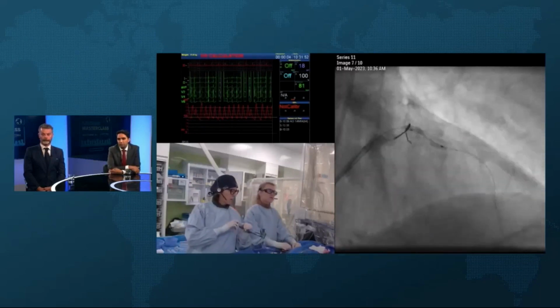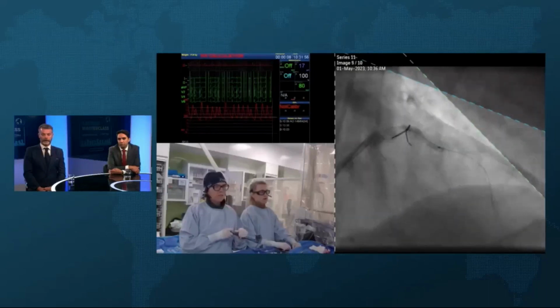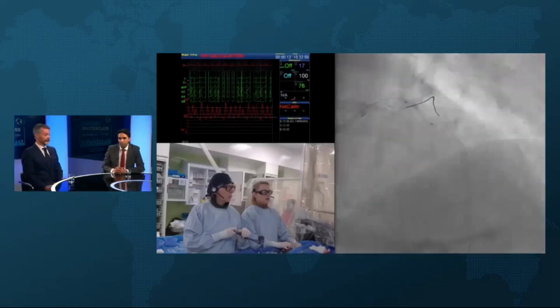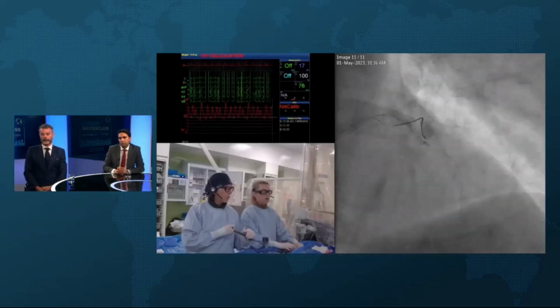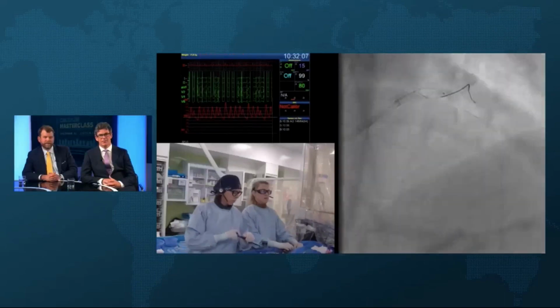There you go. Okay. That's fun. Look at that. That's 18 on the balloon. Yeah, that's not going to pop. Well, it's also good interventional practice to have that. Not necessarily where you might have even thought you were going to dog bone just based on the angiogram compared to some of the other things.